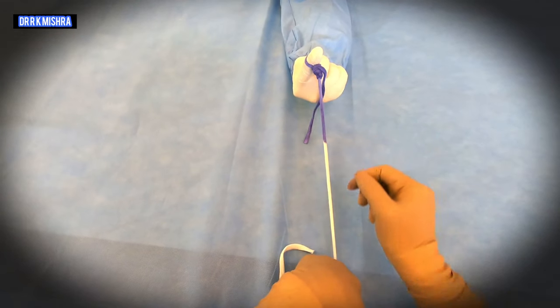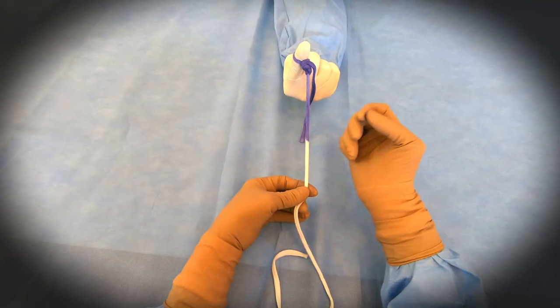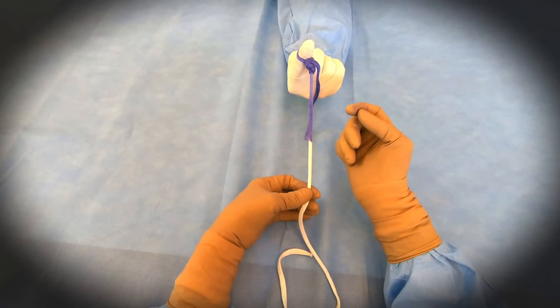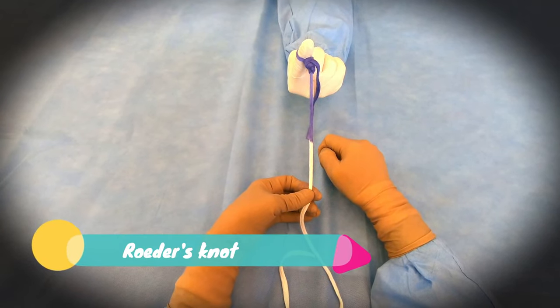This is a very good knot for any tubular structure up to six to eight millimeters in diameter, like the appendix or cystic duct. You can tie this knot securely. Thank you very much for watching this video.